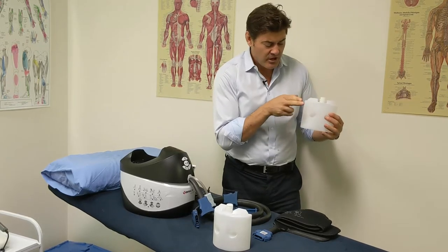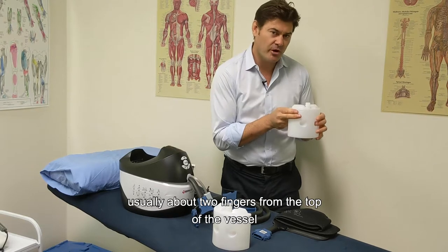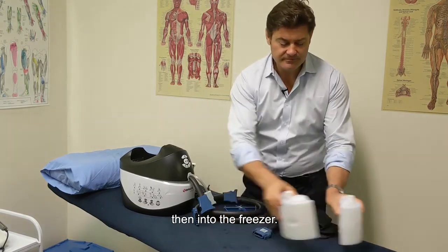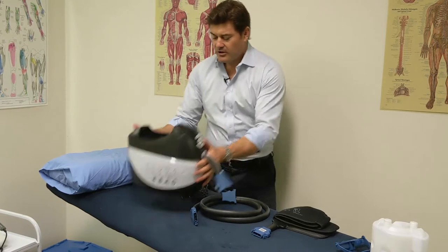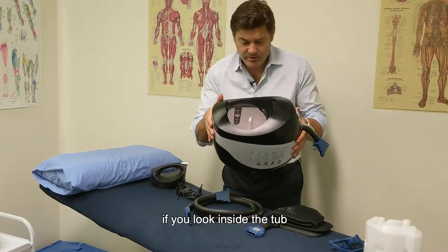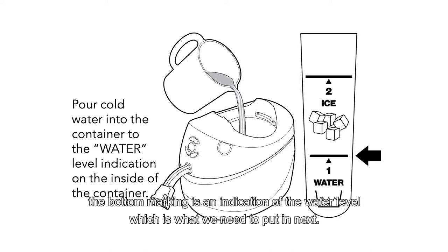Undo the lid of the ice buckets and fill them with water, leaving about two fingers of space from the top of the vessel. Put the lid back on and place them in the freezer. While you're waiting for those to freeze, let's go back to the V-Pulse. If you look inside the tub, you can see some markings — the bottom marking indicates the water level, which is what we need to fill next.